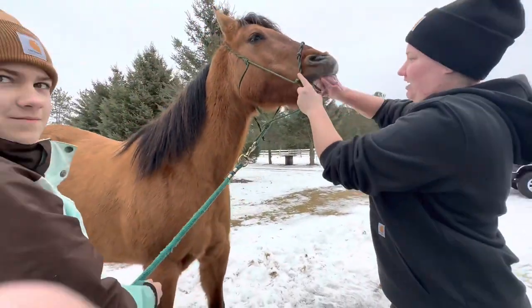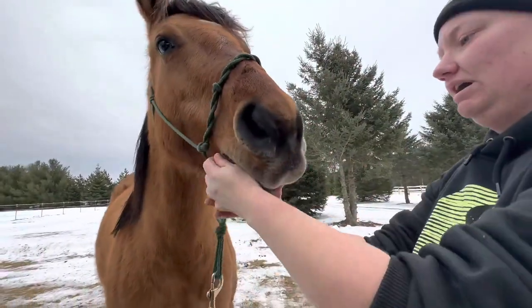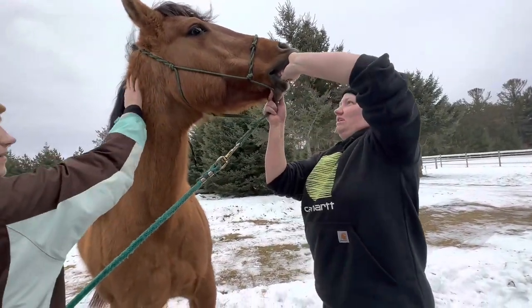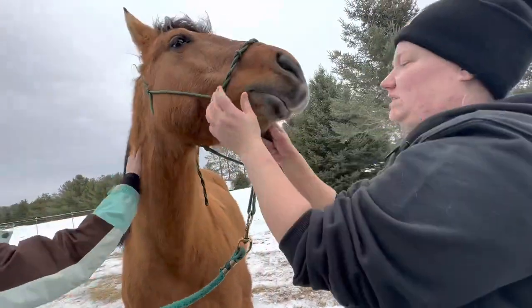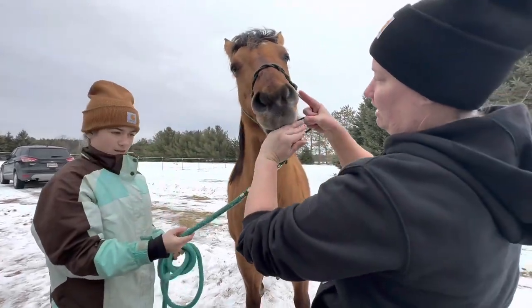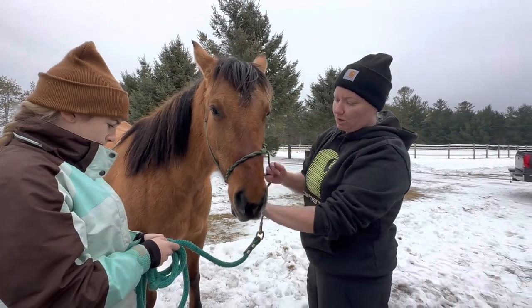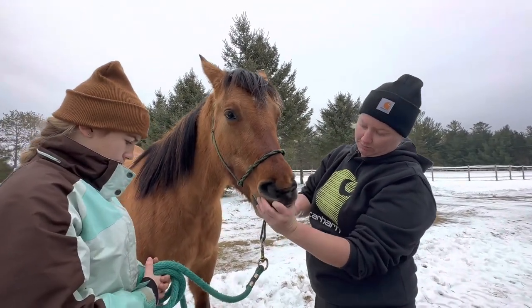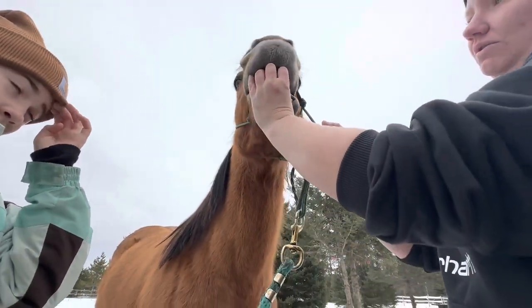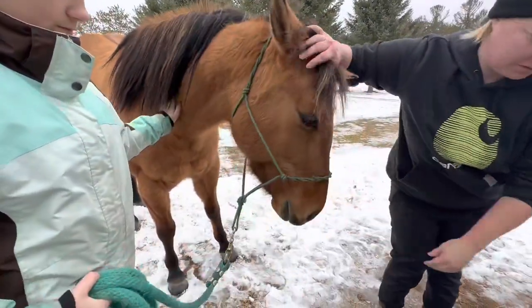And then we check for something that's called lateral excursion. And what I'm checking for here is how well she's meeting in her molars. I just checked her left side, she's excellent. And she's perfect on her right side as well. So what that means is I will not have to take anything off across all her incisors because she's already touching perfectly. If she wasn't, then what we would do, and I can demonstrate with her, is take my blade and we would go all the way across to reduce these until they were matching the length of the molars in the back. So we'll go ahead and take those hooks off.